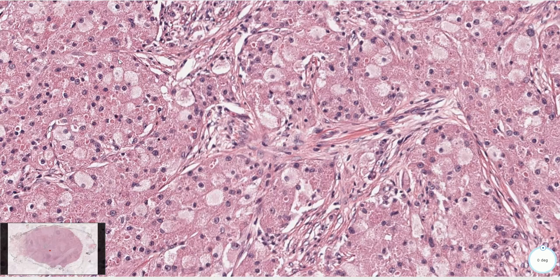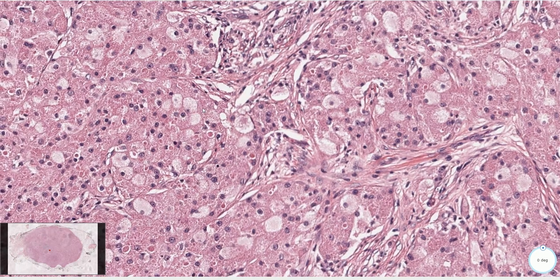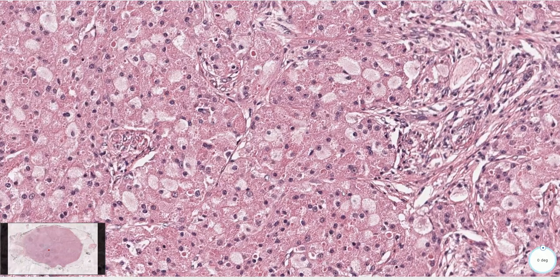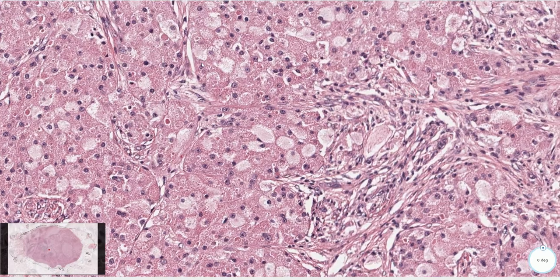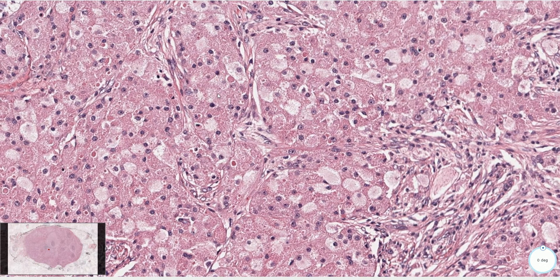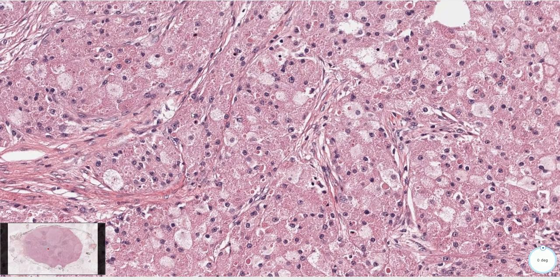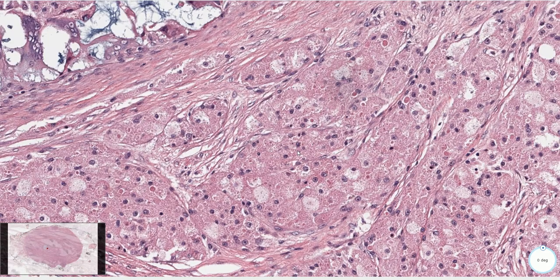Additional criteria include increased mitotic activity, higher nuclear-to-cytoplasmic ratio, and significant nuclear pleomorphism. So even though we see some of these features here, most of the cells are very uniform and bland, and this is not an example of malignant granular cell tumor.